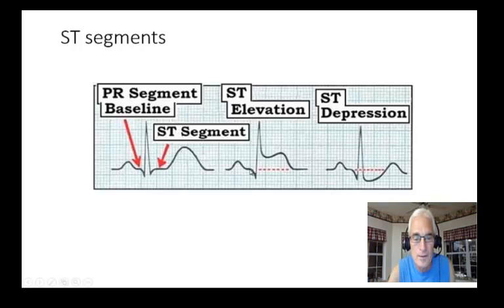Let's look at it. Here's the P-Q junction, and look at this baby, it's up one millimeter, two millimeter, three. It's way up there and it's coving. Notice it's starting to balloon up, sign of myocardial injury. And over here, ST depression. There's the P-Q junction. Now look, we're down one, two, three. Here by convention, you have to go over two blocks, point zero eight over, then look at where the ST depression is. You're down about three millimeters. That's a sign of ischemia, what we look for in treadmill stress testing.